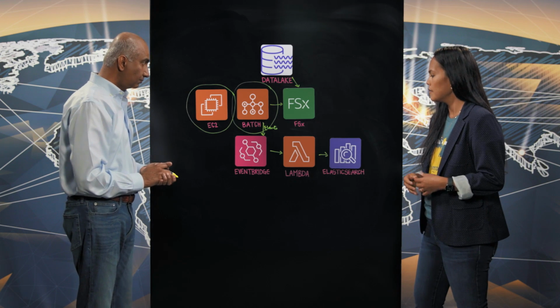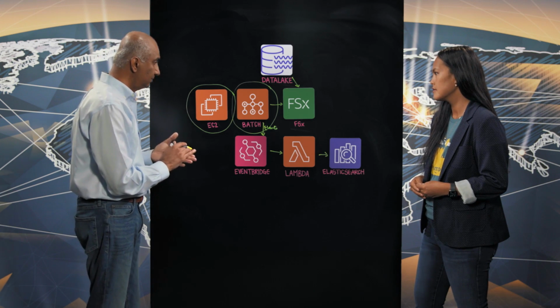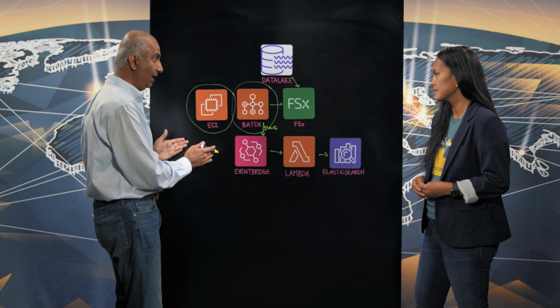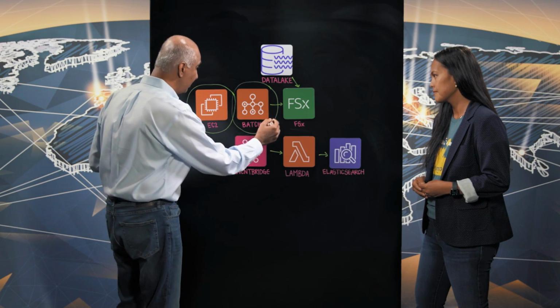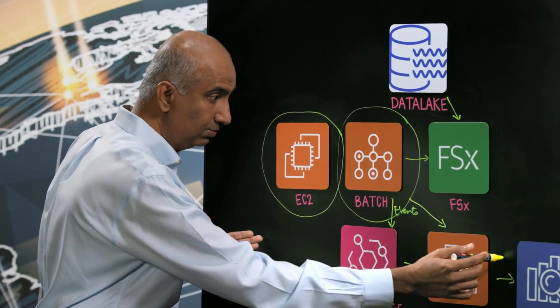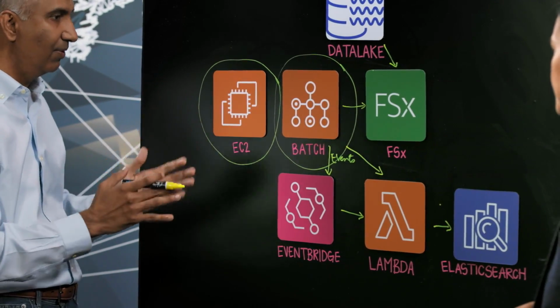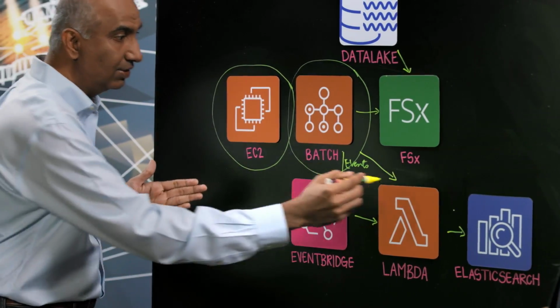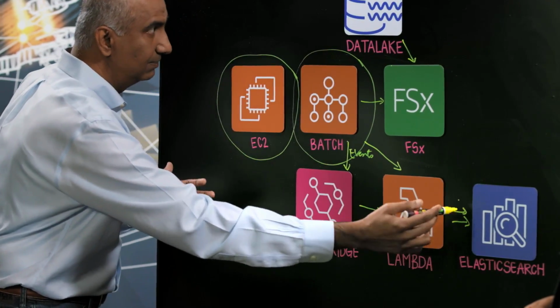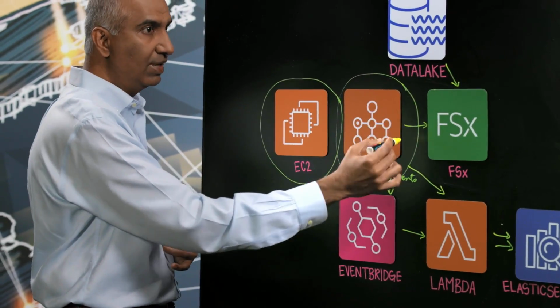From the data science perspective, how do they visualize and consume the data sets? Our data scientists or biologists are the primary consumers of this pipeline. We have all the logs being sent from AWS Batch into Elasticsearch. If they are more technical, they can look into the logs to know what subjects have been processed. That information is communicated from AWS Batch to Lambda, and Lambda indexes it. And the second thing is the output that's produced during the processing.